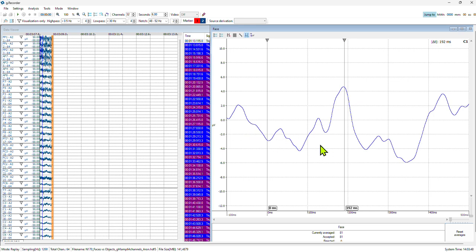Now, one thing that is not shown over here, because I don't have the TMS trace with me at hand, is that for the TMS you will have the pulse artifact, which is like 10-20 milliseconds when you see it online, and you should mask it.